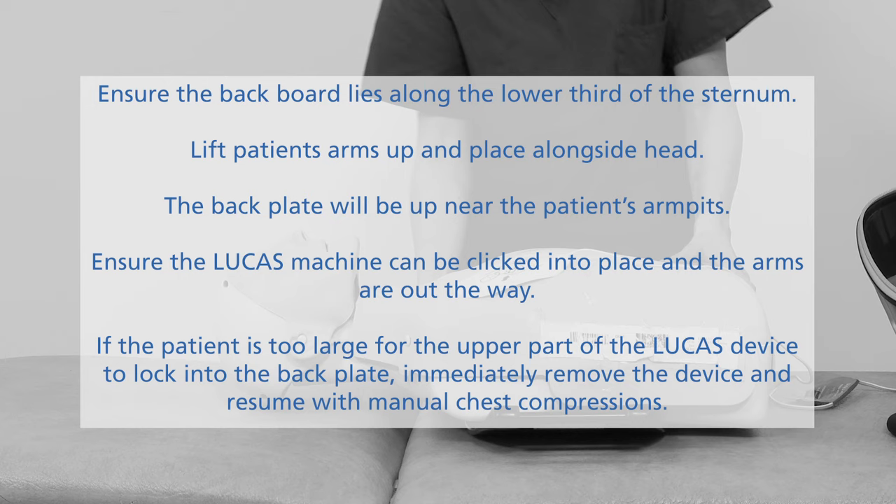Considerations include the width of the patient — will the machine fit over? If the patient is too large, the upper part of the machine will not click into the back plate. If this is the case, immediately resume manual chest compressions.